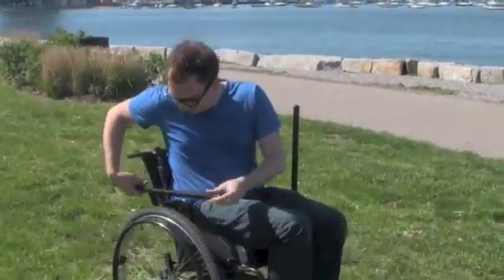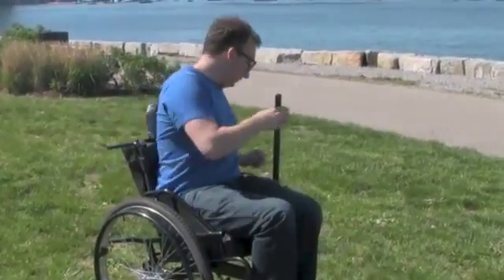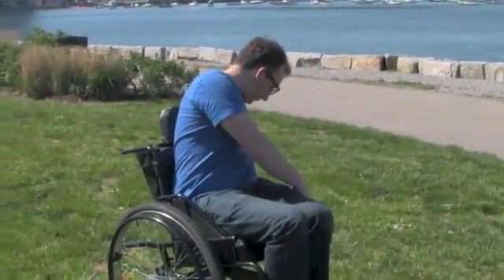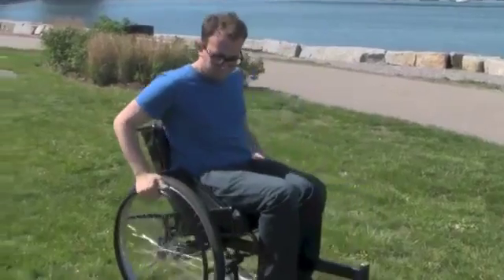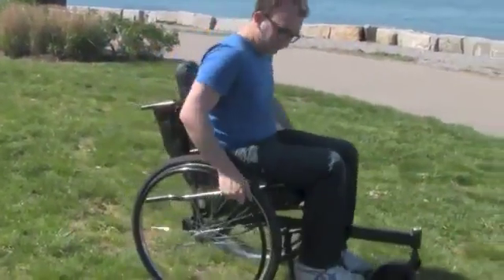The levers can be stored on the frame of the chair. Pull up to remove the lever and then insert it into the holder on the side. Then you can use the push rims like a regular wheelchair. We recommend this for indoor use.